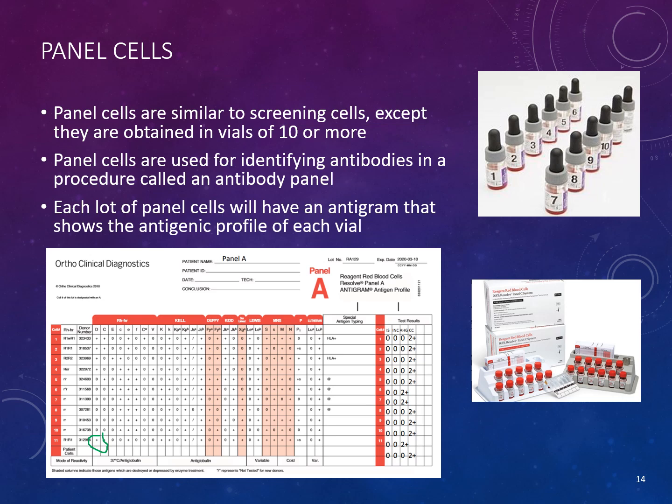You can see your negatives here versus your ones that are positive. We'll talk about how to actually interpret and work this up a little bit later on, but it's going to be based on the particular reactions the patient's plasma has with those particular reagent cells.